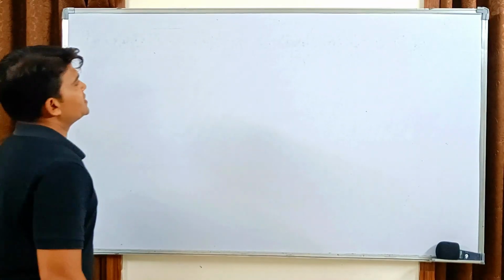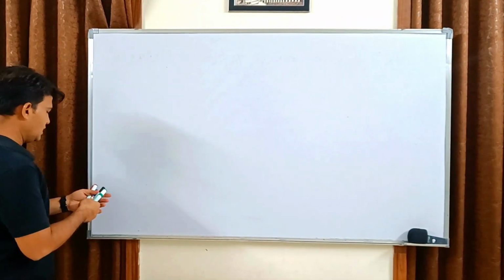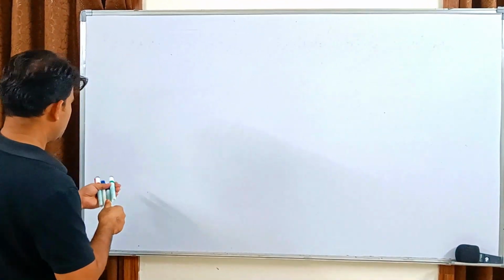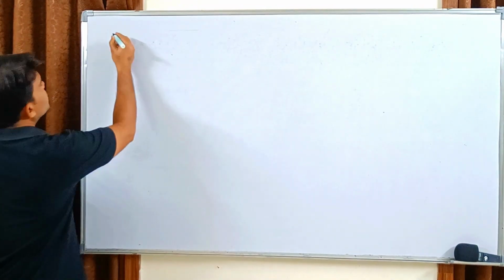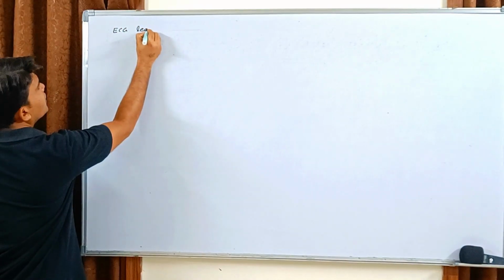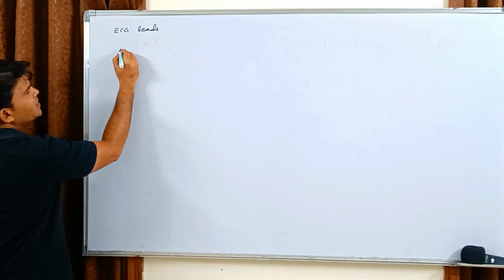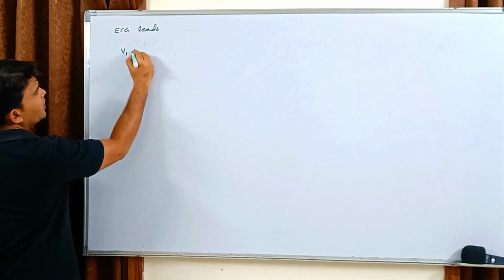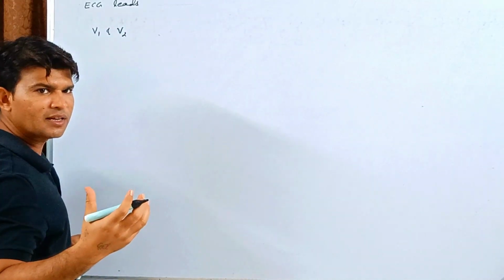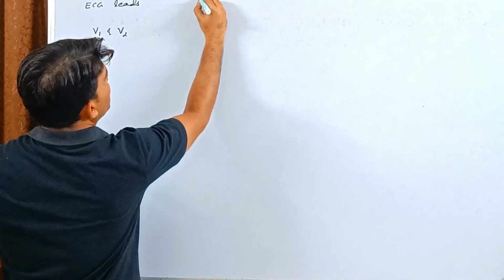Okay, let's discuss the 12 lead ECG, basically which leads represent which area. Here we have the ECG leads. ECG leads V1 and V2 basically represent the septum, right? So you can say that part of the heart.